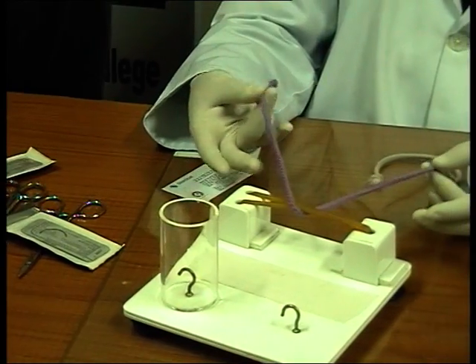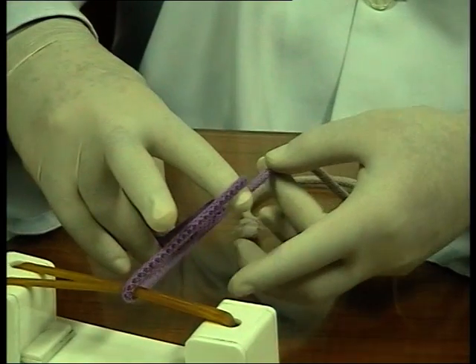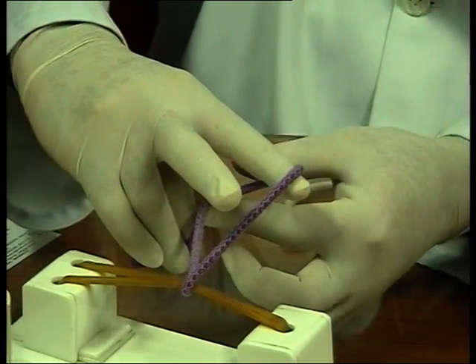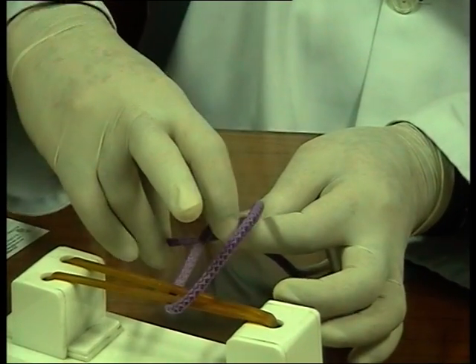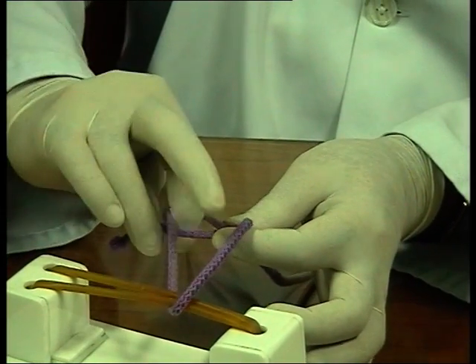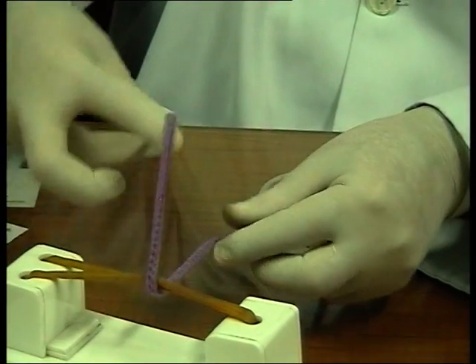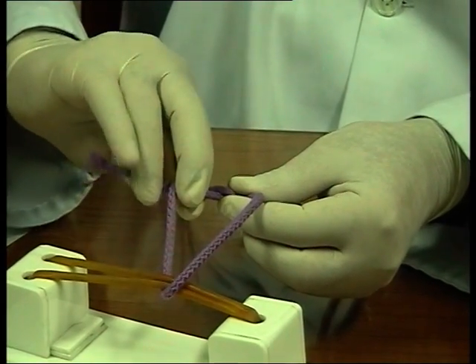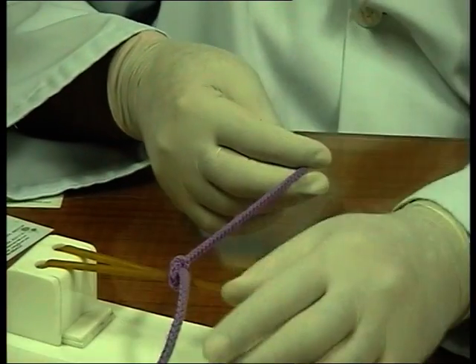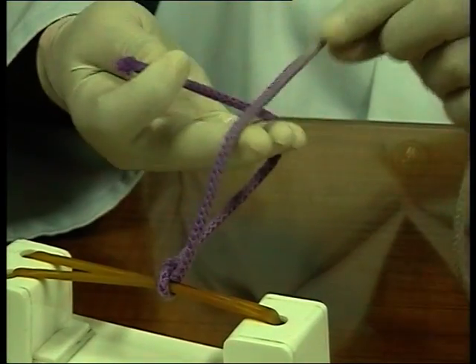This is the grip. So far is clear. This one should be closed. Don't keep it too far. No, advance it, it becomes easier. Keep it in the distance so that you can use the index. See now index can be. You can hold it. Now what am I doing? Actually I'm using index and middle to hold it. Like this. Show you again. Cross. Second part is hold it like a dart. Wrap it around your 3 fingers.